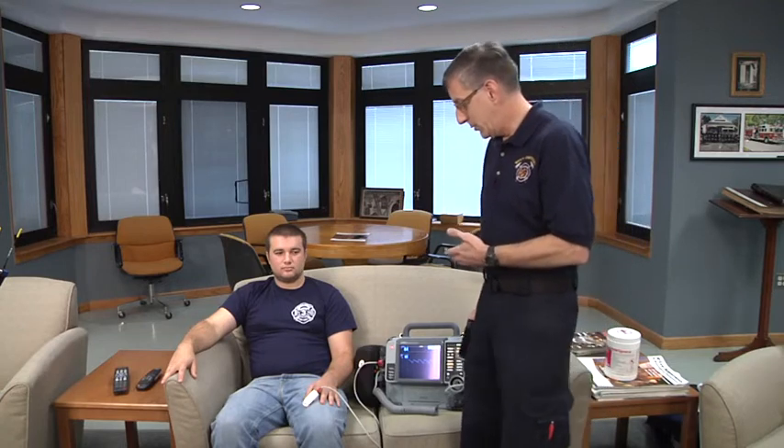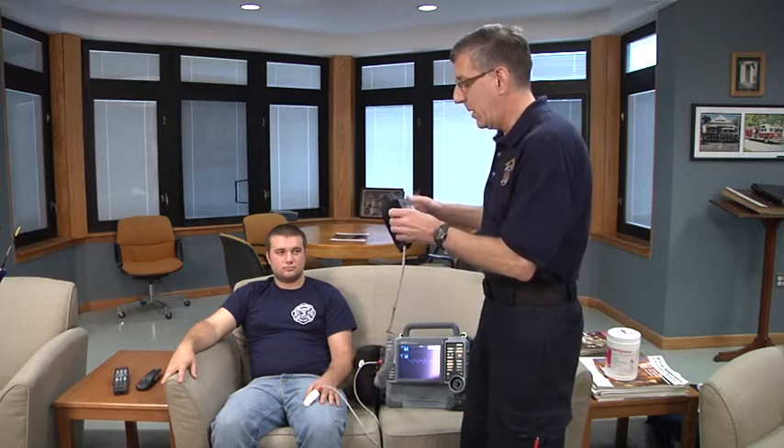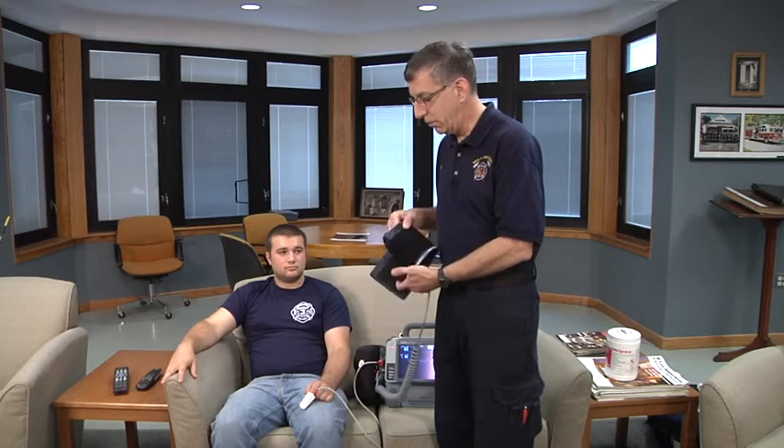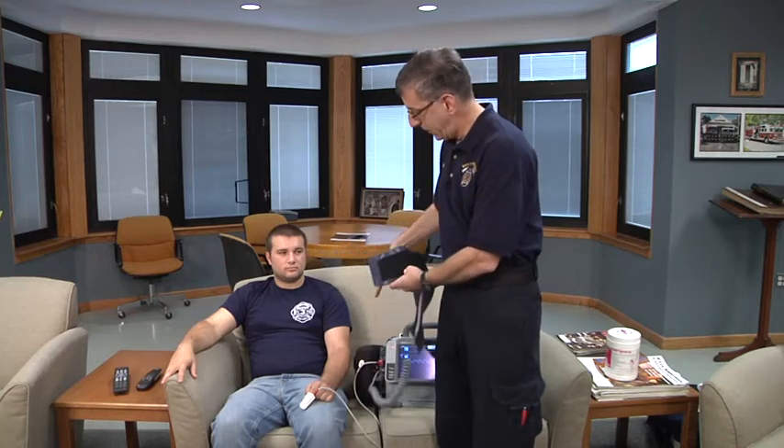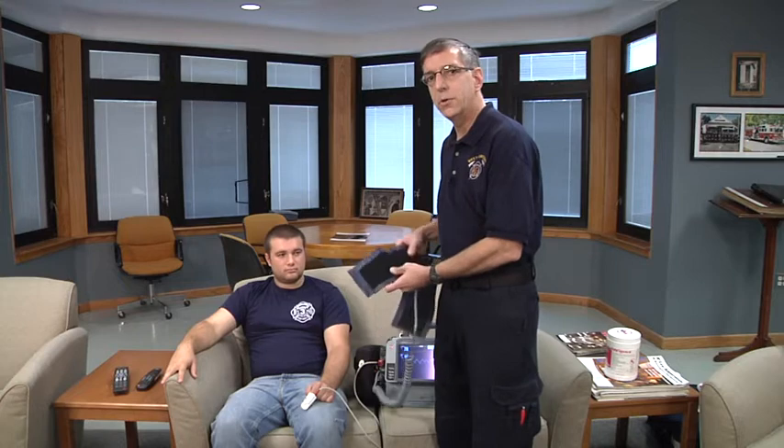Automated blood pressures or non-invasive blood pressures are now included as a skill in the EMS educational standards for EMT level providers and above. So using this technology, an electronic blood pressure measuring device, we're going to place a cuff on the patient. Measuring the cuff is somewhat of a challenge for accuracy. What we would like to see is a cuff whose bladder actually covers 40% of the circumference of the arm.